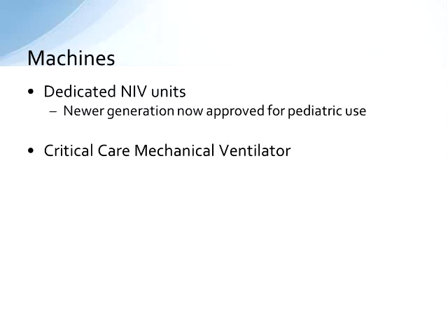So they're a little bit easier to trigger. They have more compatible flow rates for our smallest patients and seem to work better than some of the older devices. Despite that, in some patients, our smallest babies, we here at our institution still continue to use the critical care ventilator for our smallest patients on non-invasive ventilation because it's used to ventilate much smaller children. So that seems to work better. But having said that, again, there's more devices out there that are readily available for our patients.